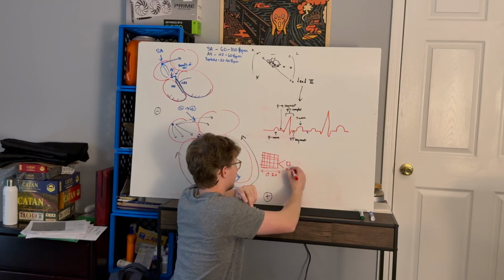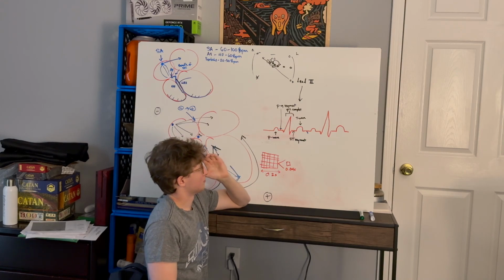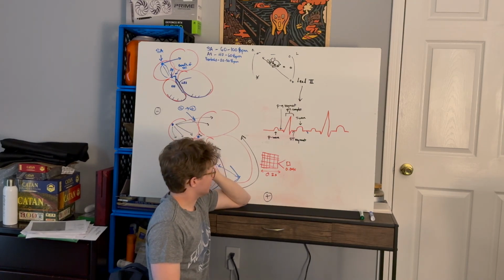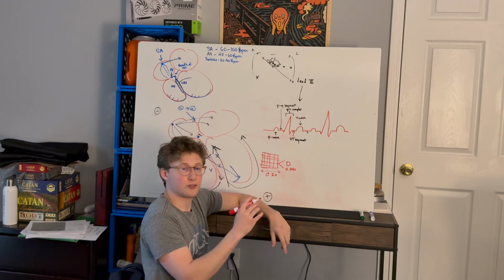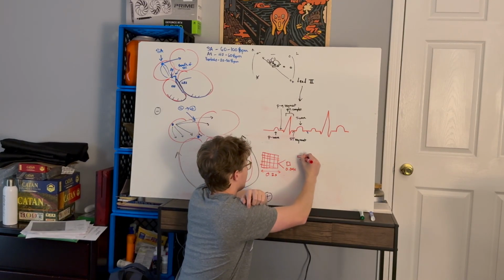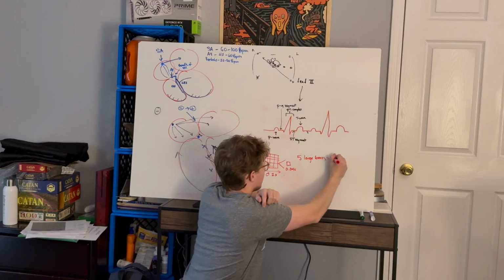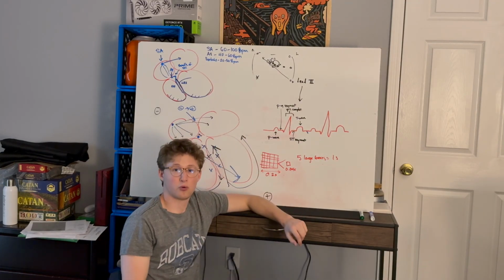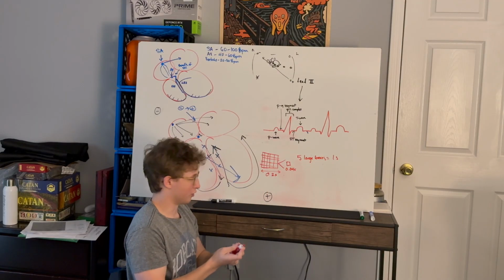So 0.04 seconds. Five large boxes represent 1 whole second. Okay? So that's good to know.